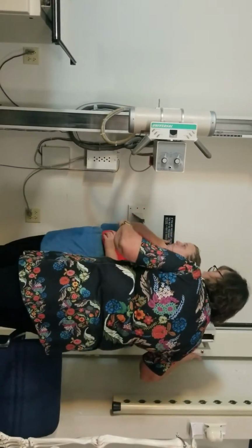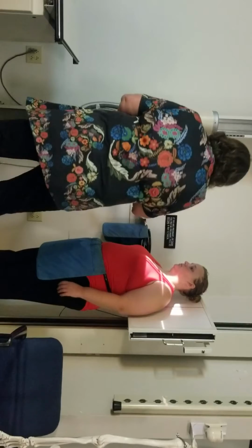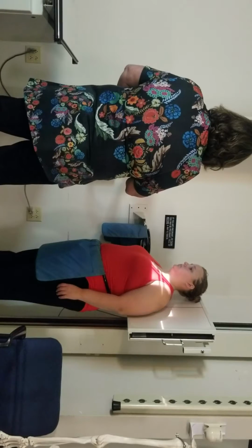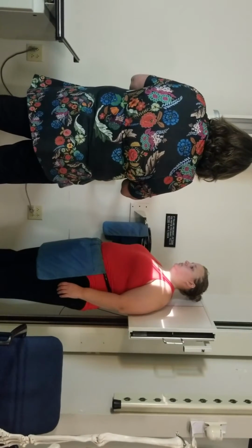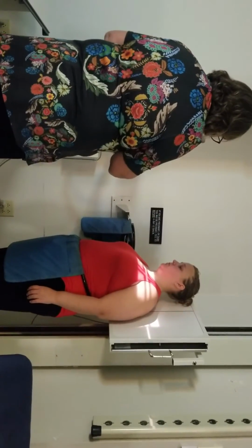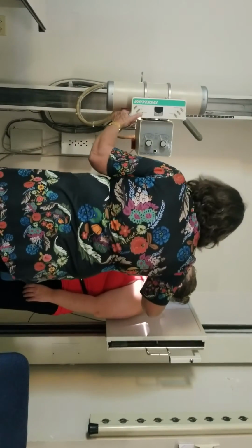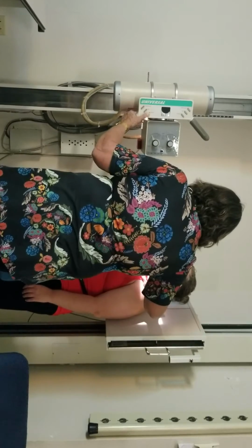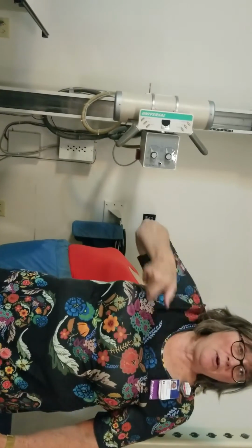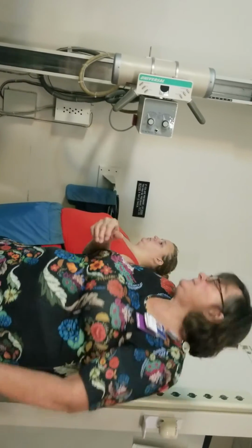So I'm still going to be at 40 SID. And this one is really very easy. So we're going to change our collimation to make it 12 length like that and small. And I'm just going to find Ellen's clavicle, and I'm going to put the clavicle right in the middle of my CR. Do you guys see that? So the one that goes this way across, her clavicle's right in the middle of the two lines. Everybody good with that?